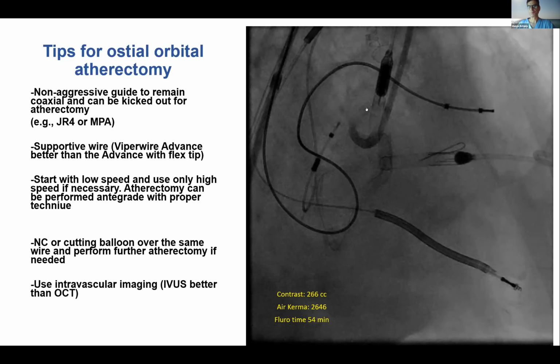Laser is very useful, and sometimes actually the laser doesn't necessarily cross the lesion, but it can modify it enough that then subsequent things like balloons or atherectomy, burrs or crowns can actually cross. And one option we haven't discussed is, if everything else fails, to potentially use the subintimal techniques, in which you can advance a guide wire intentionally around, kind of subintimally around that area of heavy calcification and inflate a small balloon there, essentially crushing the calcium from the outside. Again, aggressive technique, requires that you are very familiar and very comfortable with CTO techniques, but can work.